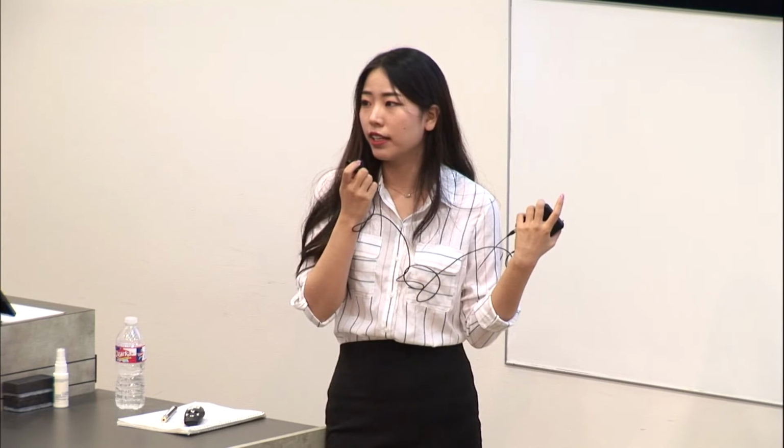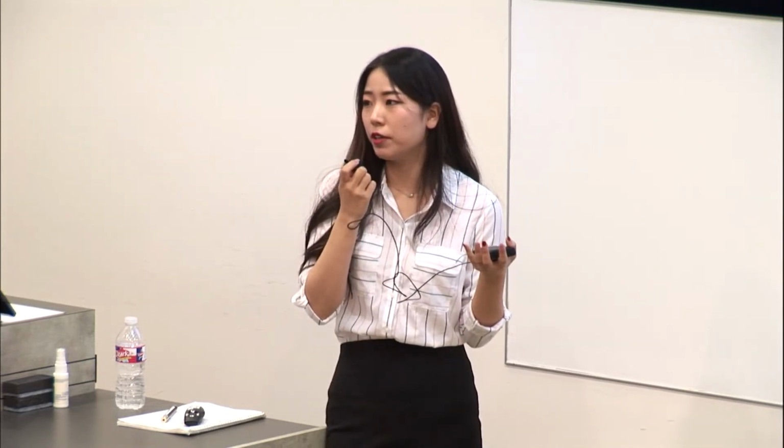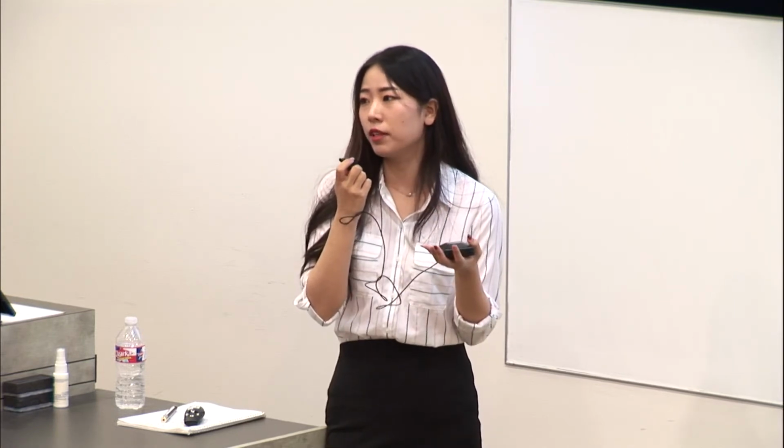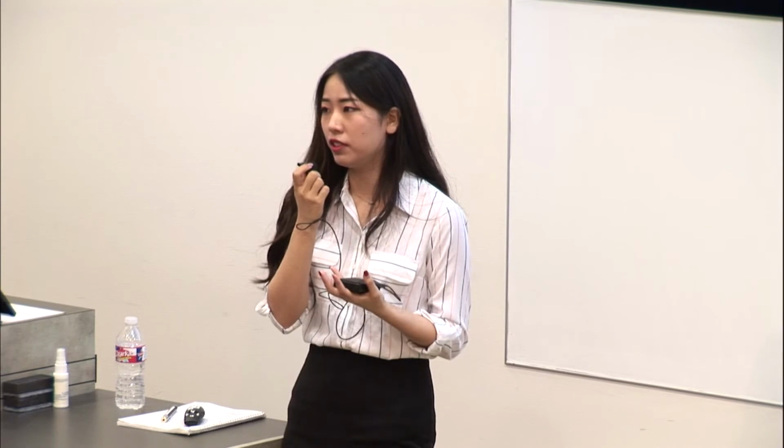Actually, if you remember, for dataset A and B, we were trying out if the uneven distribution of the images will have an influence on the computer algorithm accuracy. Dataset A has an uneven distribution, B is an even distribution, and the accuracy is not obviously different. So we draw the conclusion that the uneven distribution of the images in their different categories won't have a large influence on the computer algorithm's accuracy.